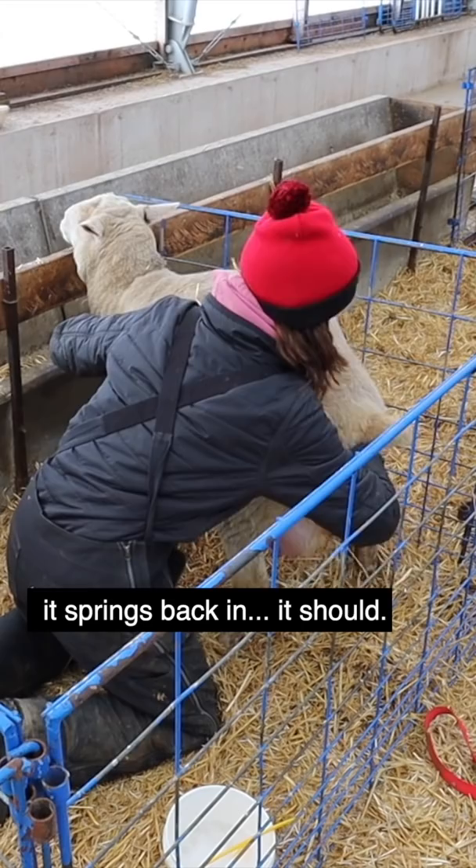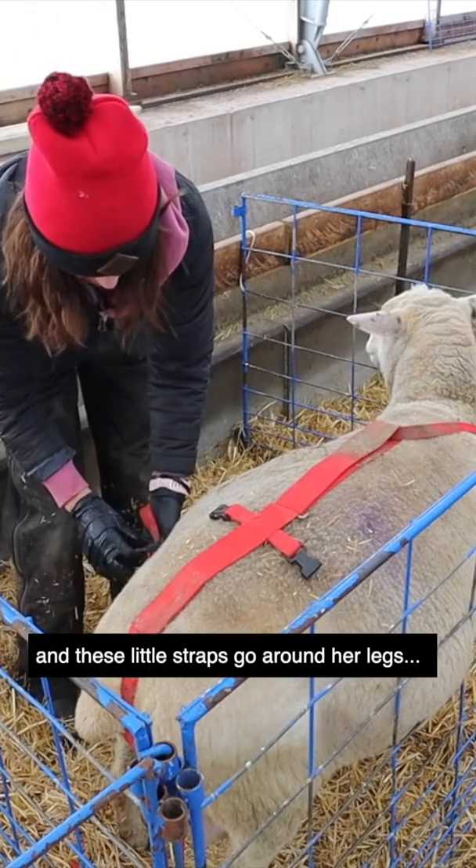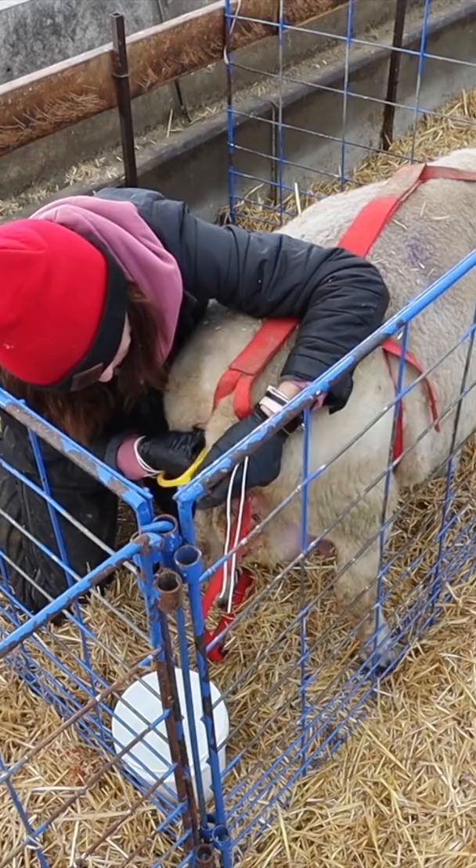Okay, she's in — no problem, that was a good one. I might actually put the harness on first. This goes under the tail like so, and then these little straps go around her legs. There we go. It's nice and warm so it shouldn't bug her too much.